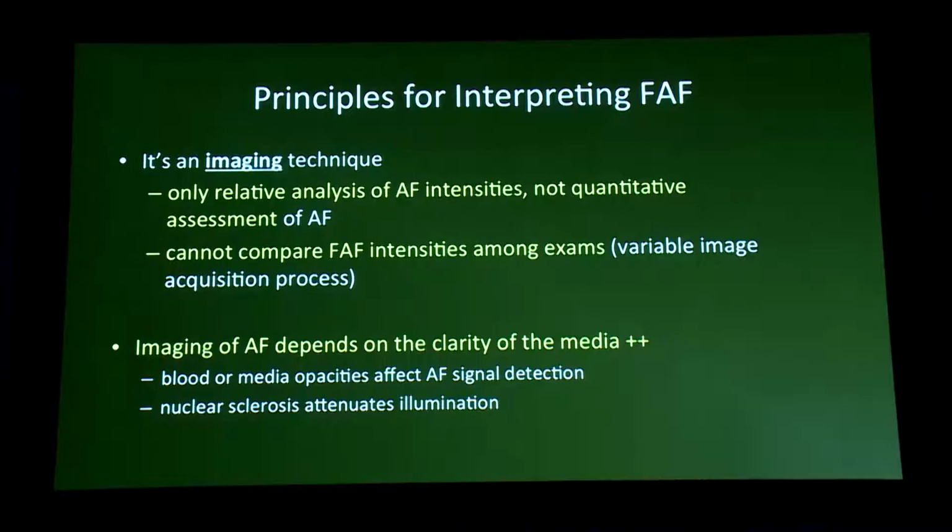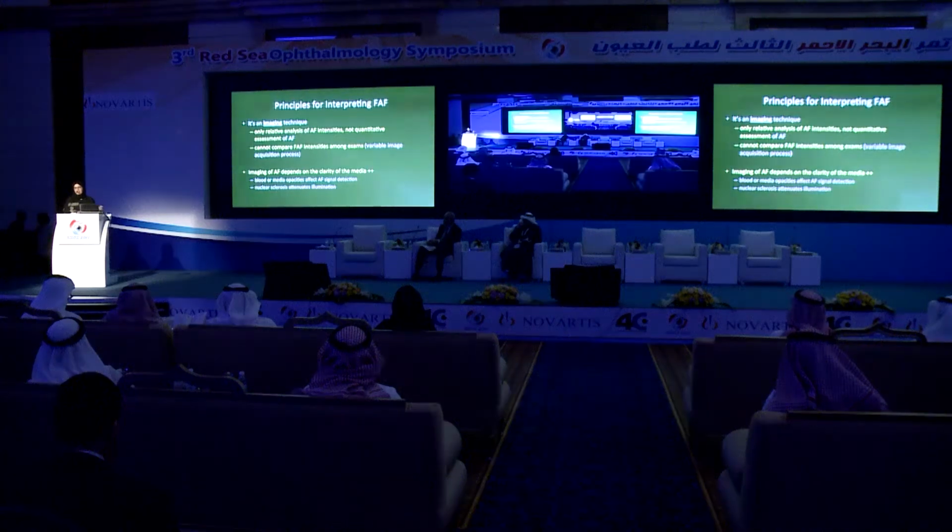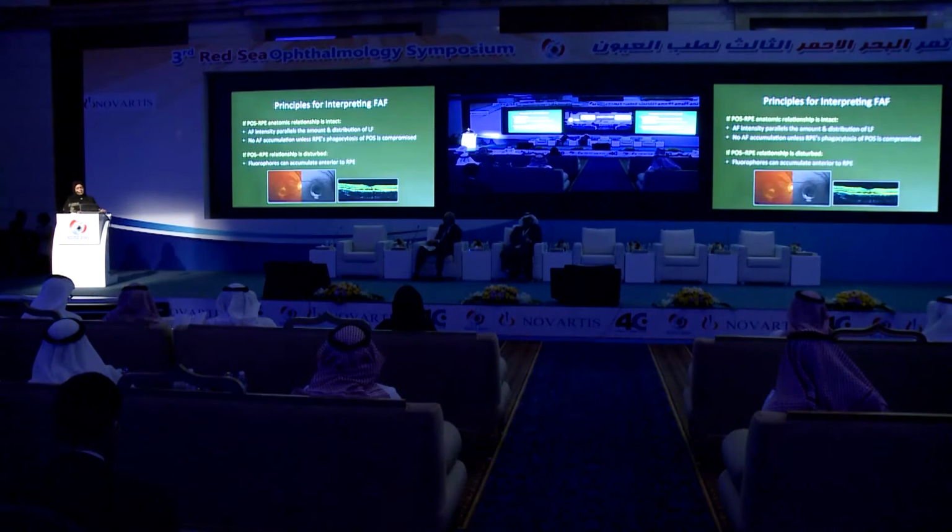You have to remember that fundus autofluorescence is an imaging technique, so it will only provide you a relative analysis of autofluorescence intensities and not a quantitative analysis of how much lipofuscin is in the eye. And you cannot compare the intensities of the autofluorescence from one exam to another because the situation between a test and another is different. And you also have to remember, because it's an imaging technique, it will depend on the clarity of the media. So if you have blood or lens nuclear sclerosis or anything else in the media, that's going to interfere with the signal detection.